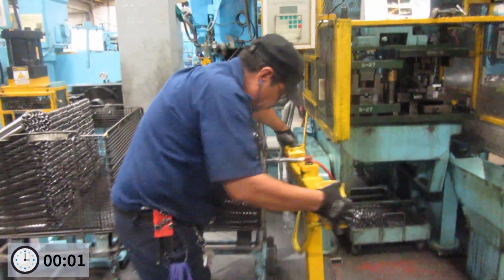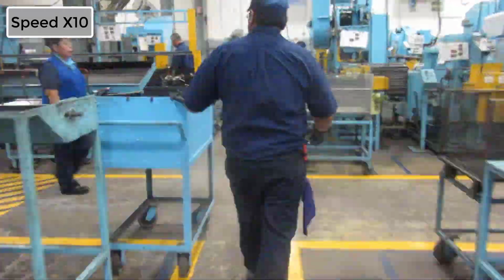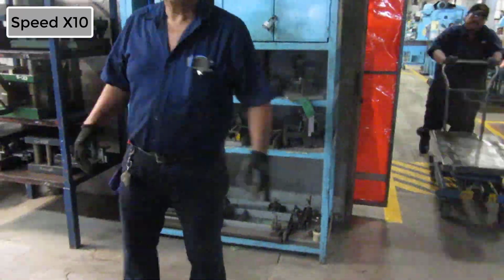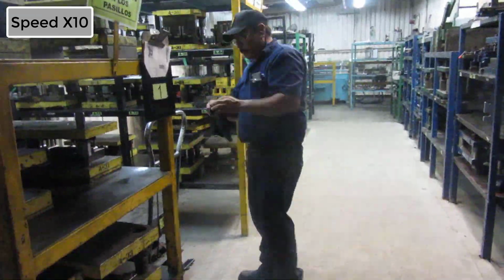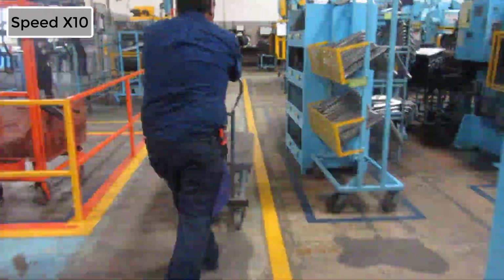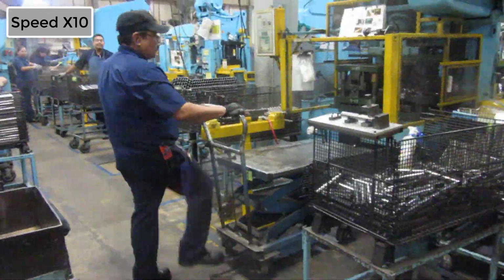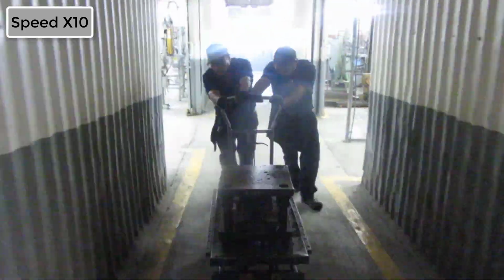The video starts with the setup guy walking to the die room, and just for the sake of this module, I increased the speed of the video. He's heading to the room to get the die card. He's looking for the card. After he finds it, he has to complete a form, which we consider a non-value added activity. Once he arrives at the press, he has to raise the card table to the same height as the bolster of the press, using a pedal multiple times. Now he's able to take off the old die from the machine to take it to the die room. Take a look at all the distance he has to walk over and over again.